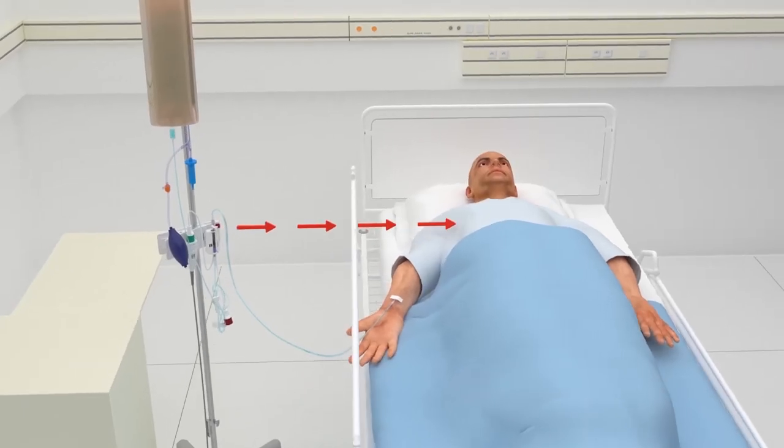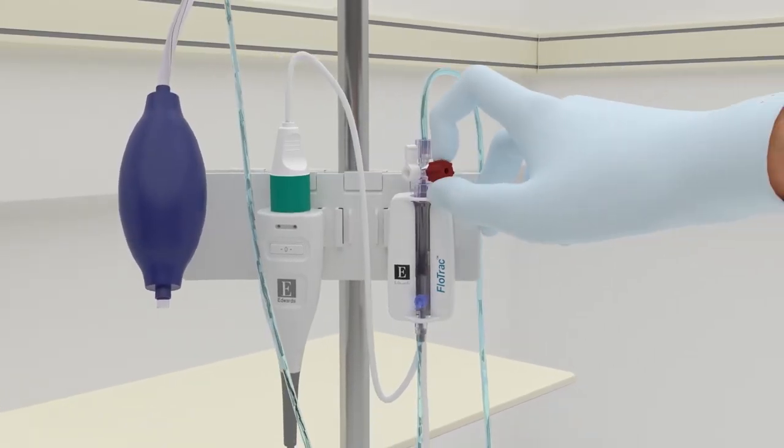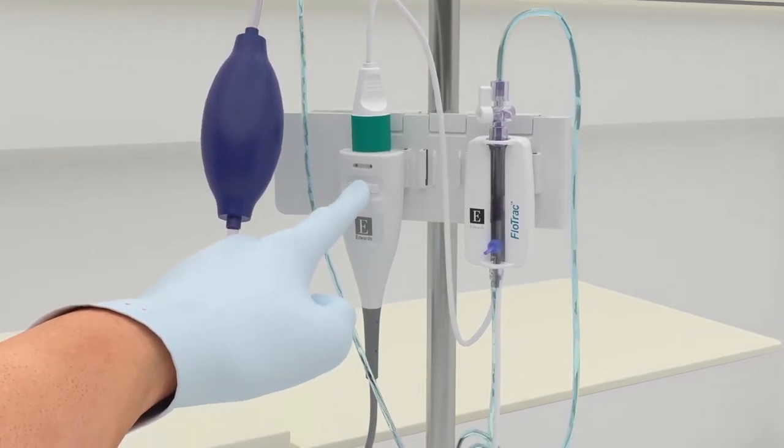Level the FlowTrack sensor to the phlebostatic axis. Open the FlowTrack sensor to atmospheric air. Hold down the zero button for three seconds to pull up the zero screen.